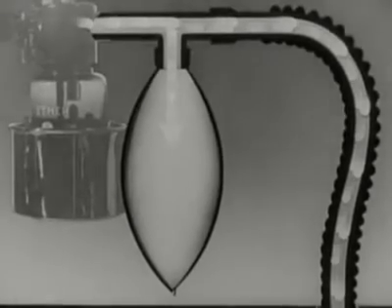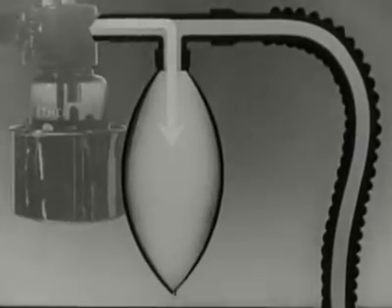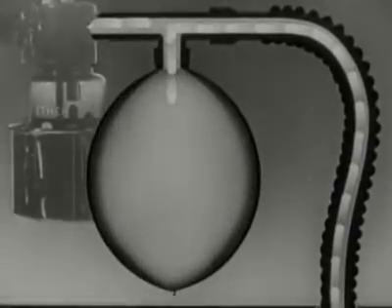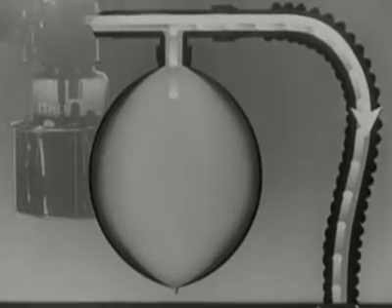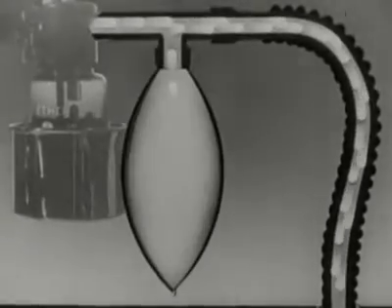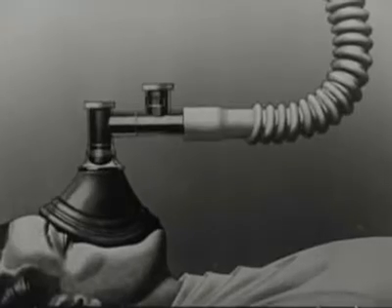The gases from the machine and those blown up the hose fill the bag. The flow continues down the hose when the bag is full and the patient inhales. Now let's see what happens nearer the patient.